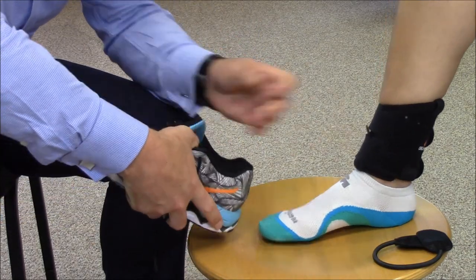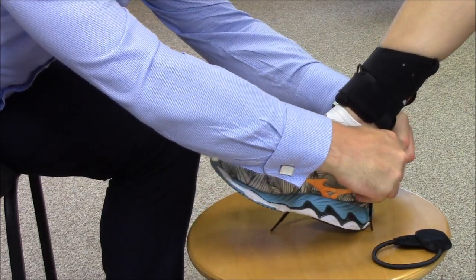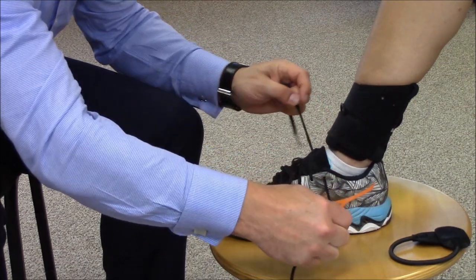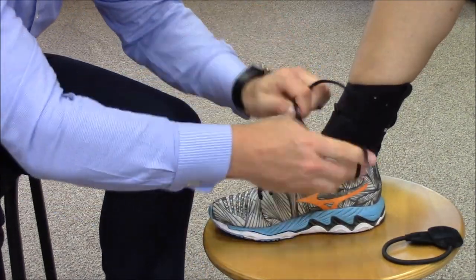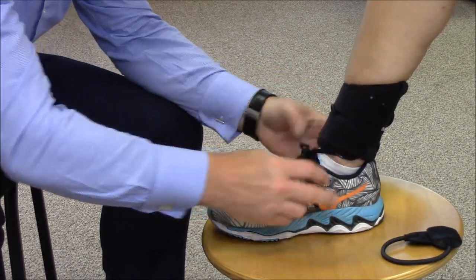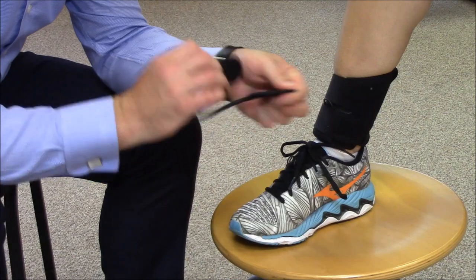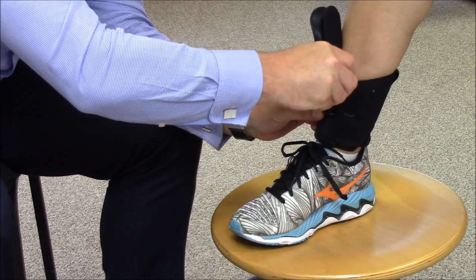Once in situ, don footwear and fasten the lace. Fold the tension strap in half, slot through the D-loop at the front of the ankle strap, and loop over the tongue and hook attachment.